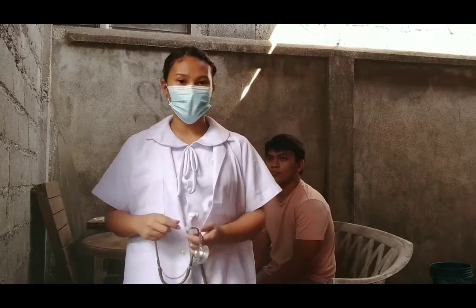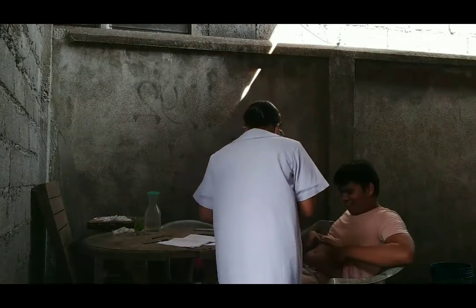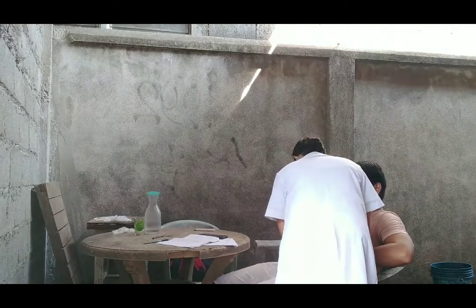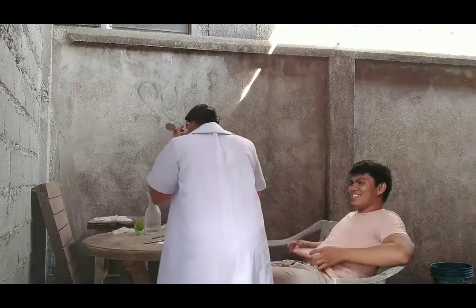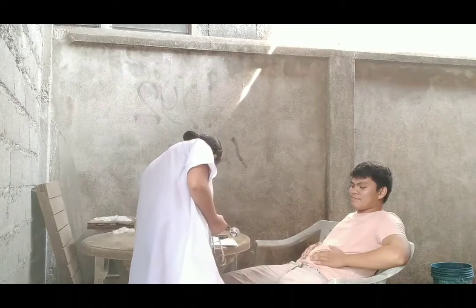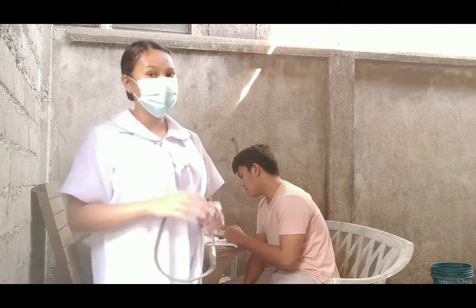So now I will auscultate his abdomen for any bowel sounds. So, as I auscultate, there are no audible bowel sounds.